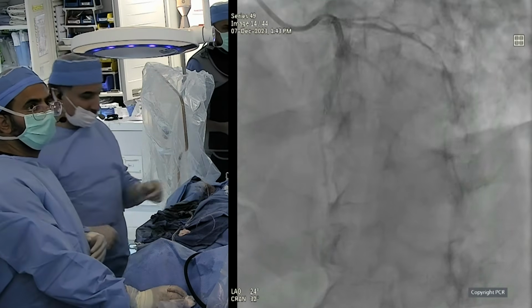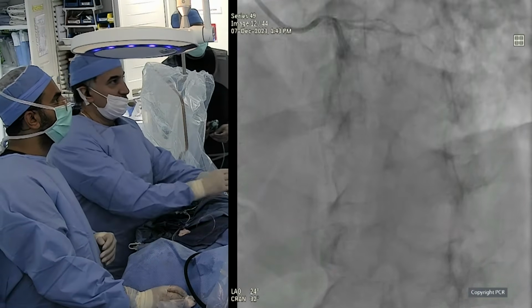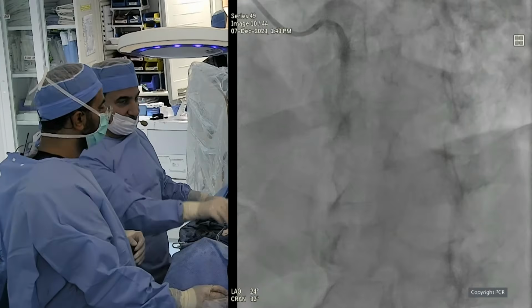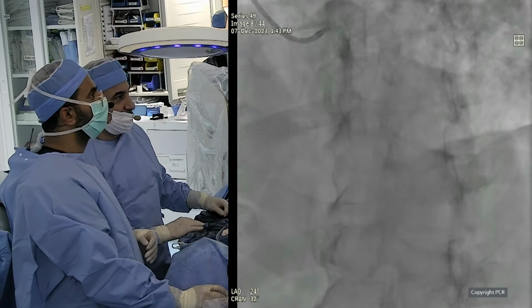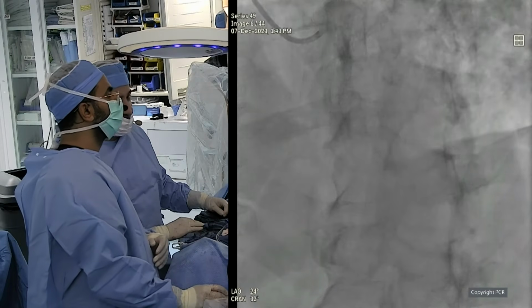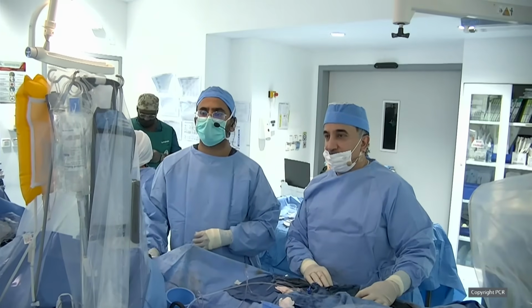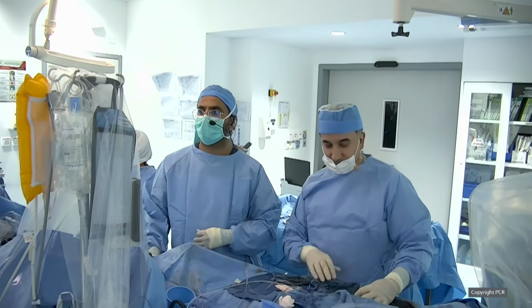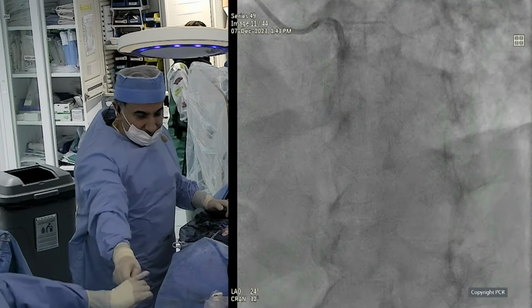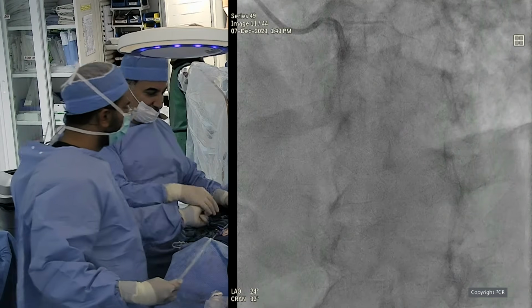We are talking about the diagonal here with Julio, and I think all of us agree the flow in the diagonal is nice, all the branches maintained. I don't see a point to intervene. We did BBC 1, if you recall, and in the provisional arm it was clear that a case like that we would leave alone because it was TIMI 3 flow, no dissection, no pain, no ischemia, and the outcomes were better. There is even a randomized German study, Tibius, based on TIMI flow 0 as the only indication to intervene. Otherwise, leave it alone, no difference in clinical outcome.